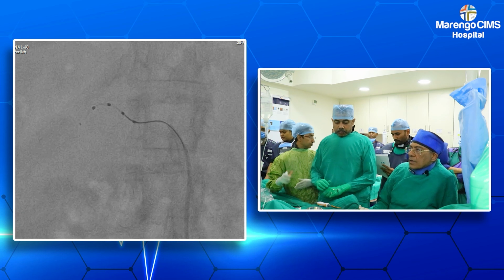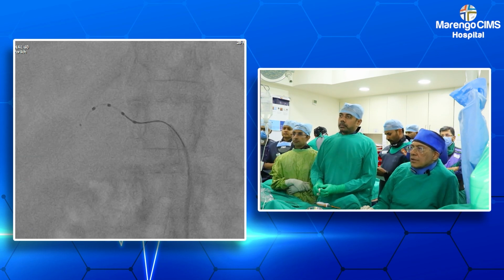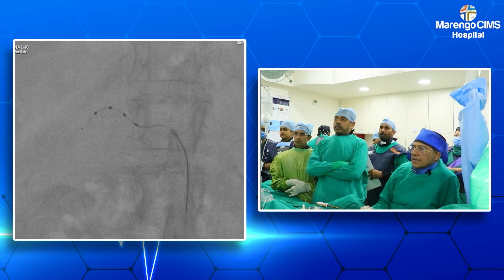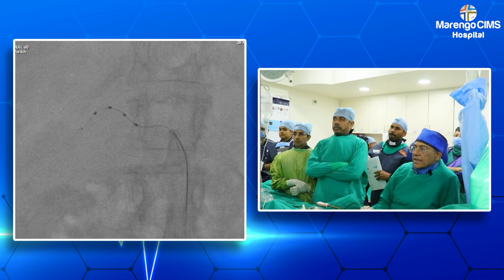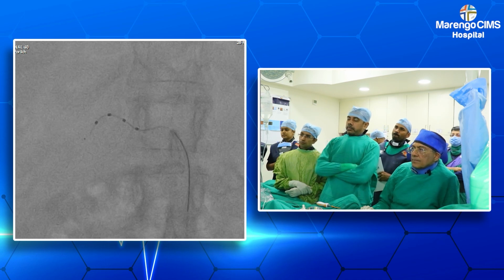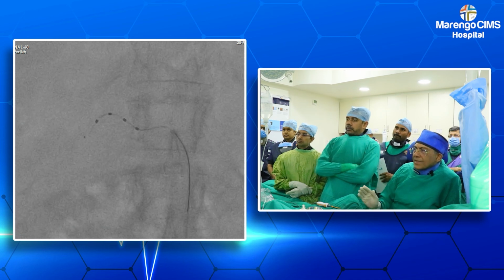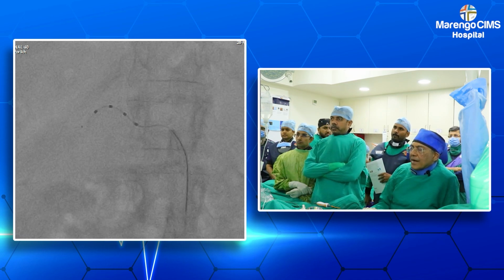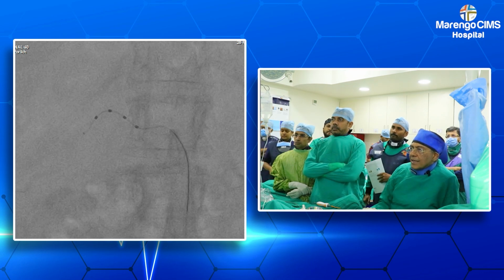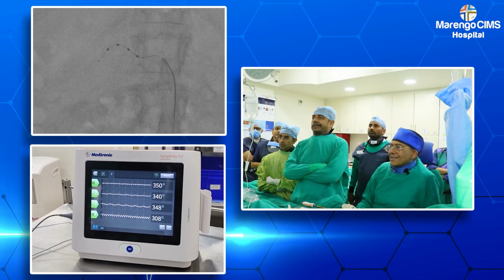As you see in the fluoro run, can I have the fluoro run? As you see in the fluoro run, with the recoil, the distal electrode has withdrawn slightly proximal to the bifurcating branch. Now, to have a 5 millimeter or less geographic miss is not advisable. So geographic miss should be more than 3 to 5 millimeter to be on the safety margin. Trying to get a total overlap entails risk of overlapping burn, which is at present not advisable. So now we'll start the second run.